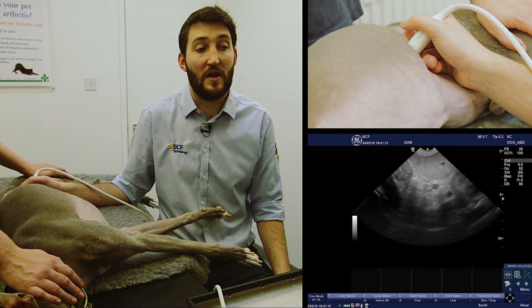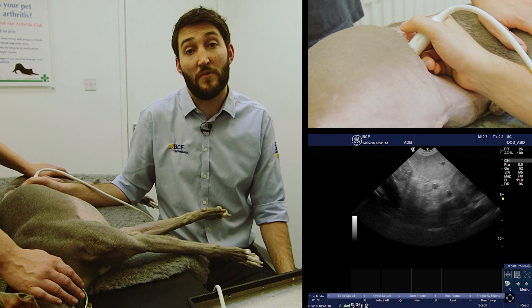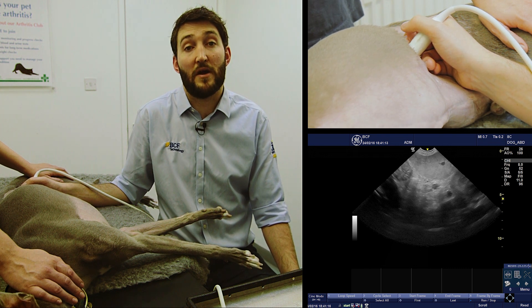We can see the left kidney, splenic vein, and spleen in the top left, and again we can identify this region of gray isoechogenicity between the splenic vein and the portal vein — that's the region of the left limb of the pancreas.